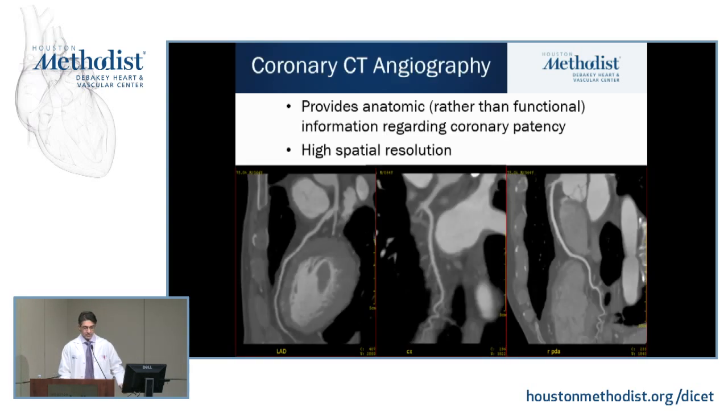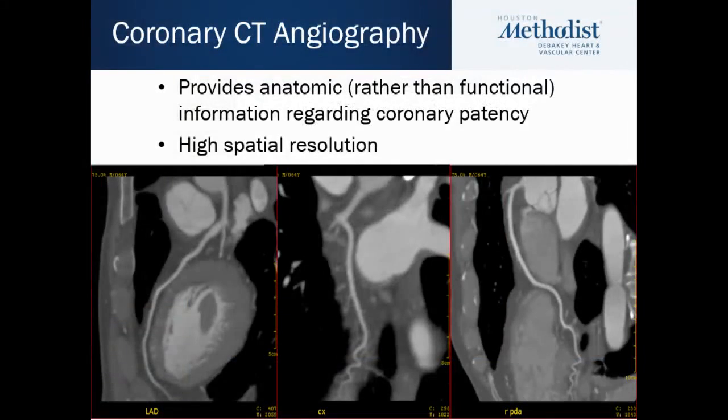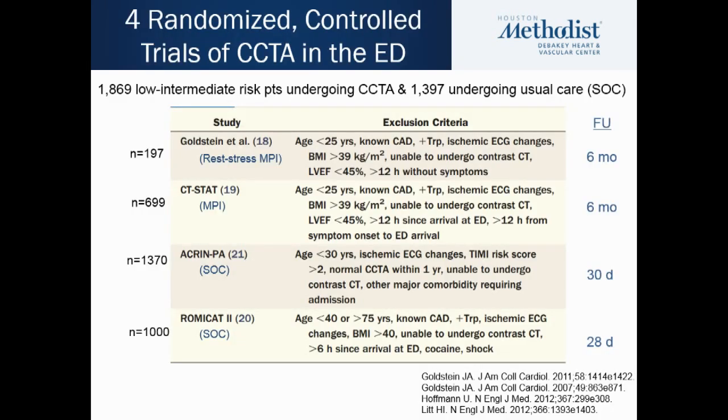All right, so moving on to CT angiography. This is also a field that has a lot of data in the ED setting. Remember, this is a technique now that, unlike the other techniques we discussed, provides more anatomy than functional information. And really, this question has been answered by 4 very large trials for a total conglomerate of almost 1,900 patients. They compared CTA to either nuclear imaging or standard of care. Standard of care was whatever the physician chose to do, be it treadmill, nuclear, or echo. And some follow-up, usually in the range from 30 days to 6 months.